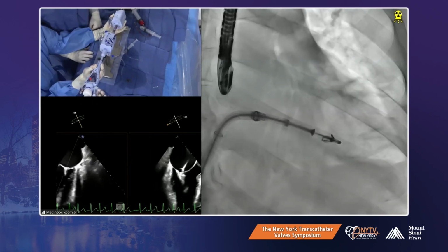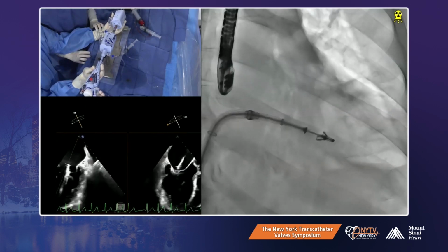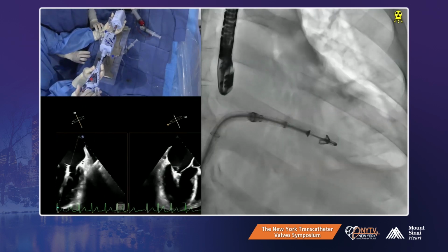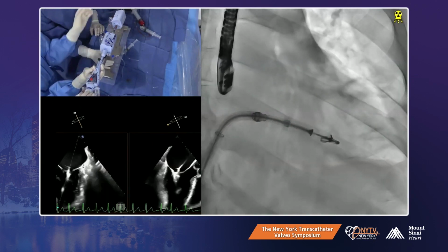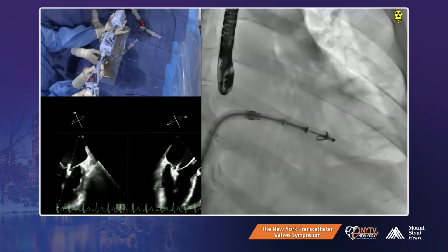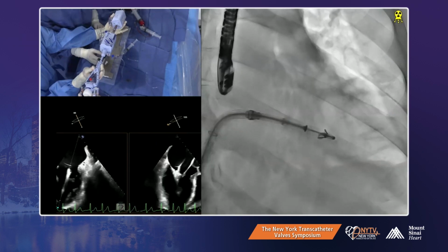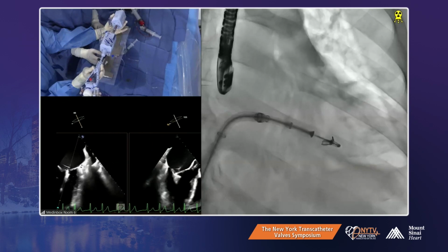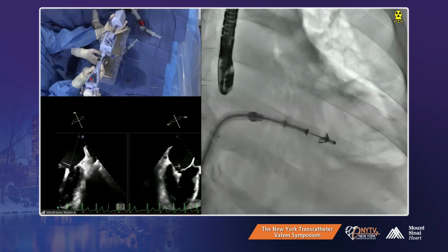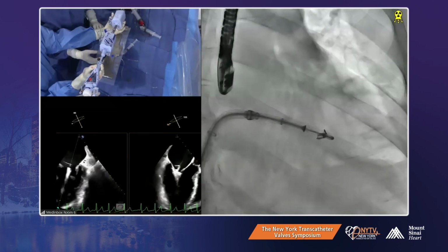Yep, you're coming up. We are way anterior now with the guide. Clip a little bit further, see if we can get underneath that anterior. Yep. Okay. What's making it so difficult for you is the trajectory. It's so anterior to posterior.